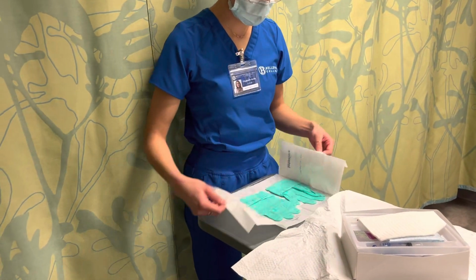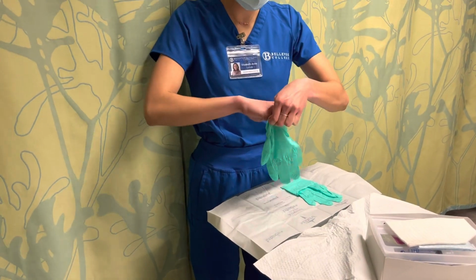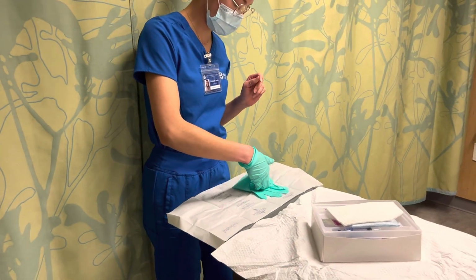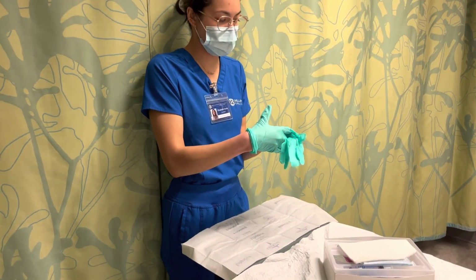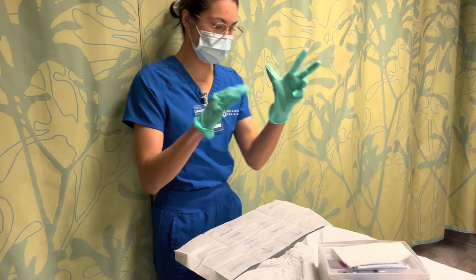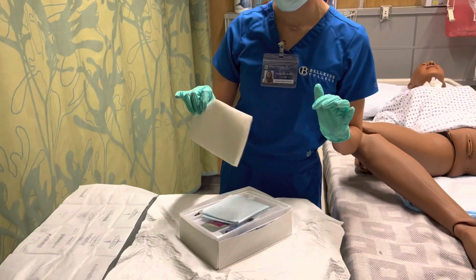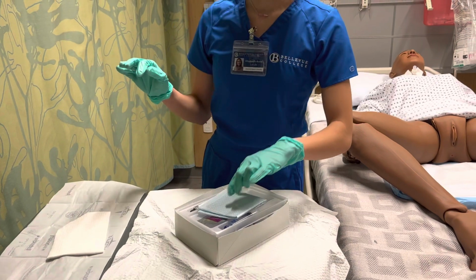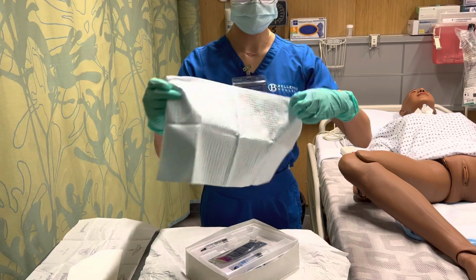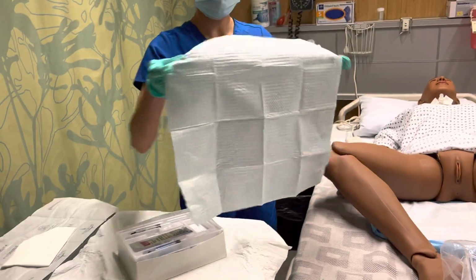Alright. Put on my sterile gloves. So I'm going to pinch here. And then scoop. Alright, now I'm sterile. Alright, so this little pad we're not going to use, so I'm going to set that to the side. And we'll set up this guy for a sterile field at my working station. Shiny side down.